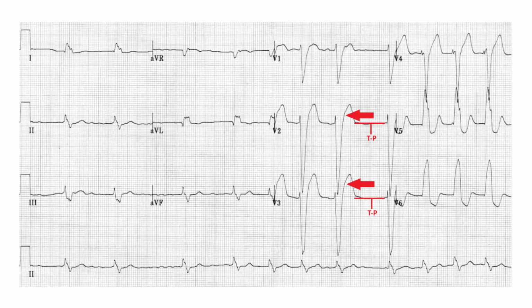So if we say those red arrows represent our J point, which is just that first change in direction where the QRS complex joins the ST segment, and we compare that to our T to P segment, which is what we're measuring against, that definitely looks like elevation. So the question is now, does that represent myocardial infarction?